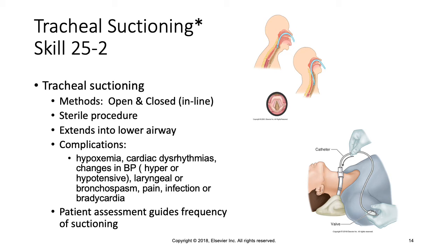So while a patient is being suctioned, we have to monitor them carefully. You will do a pre-assessment where you assess vital signs. You put the pulse oximeter on them, and you are watching that pulse oximeter for O2 sats and for their pulse throughout the procedure. If they're not tolerating the procedure well, you have to stop and put oxygen back on them, and then just wait a few minutes for them to recover.